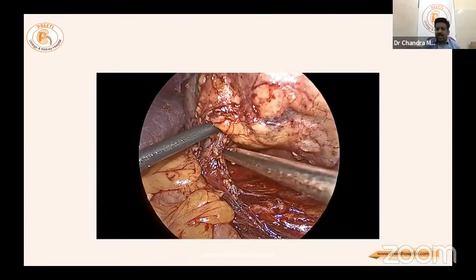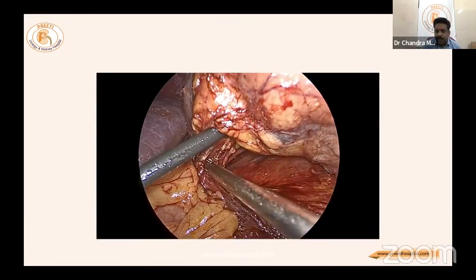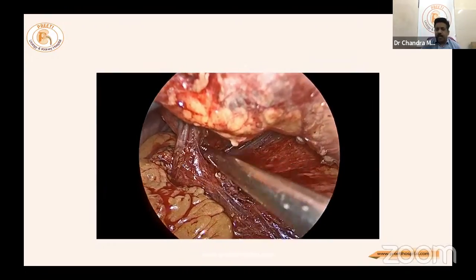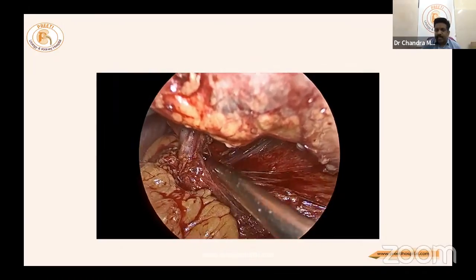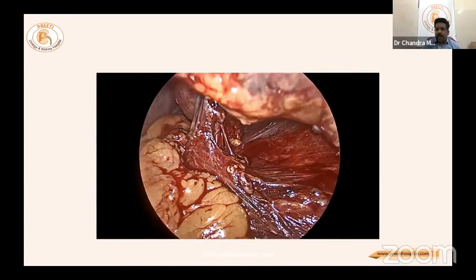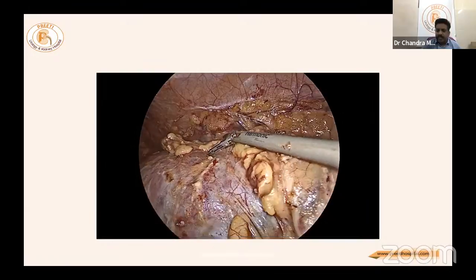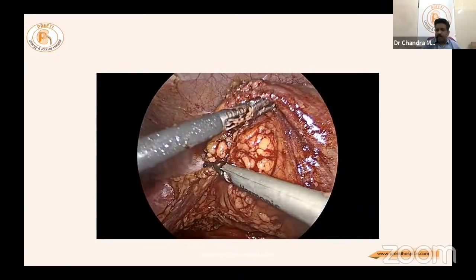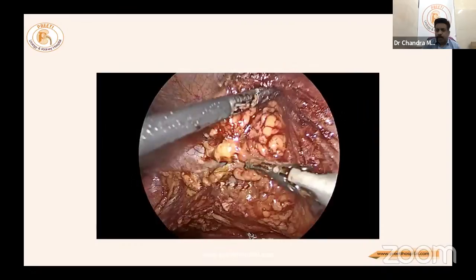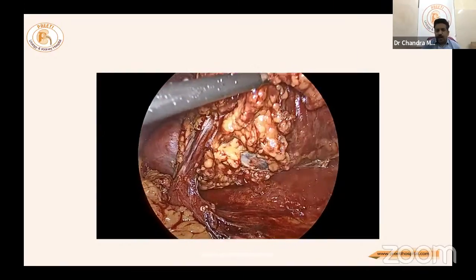Do not dissect the artery and vein in the initial phase — this may cause spasm. Unnecessary meddling will make the kidney turgid and cause ischemia. Once the plan is decided, leave the vessels and move to the next step: mobilizing fat around the hilum. The most important step in hemi nephrectomy is to go to the hilum all the way up to Gerota's fascia, sometimes opening it, and identifying all vessels.